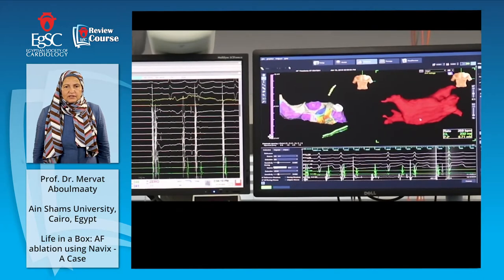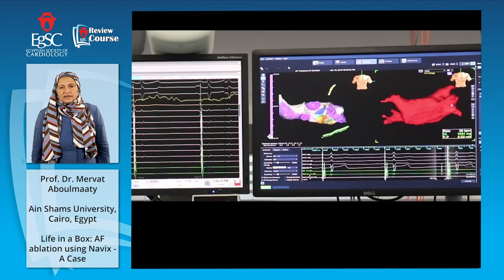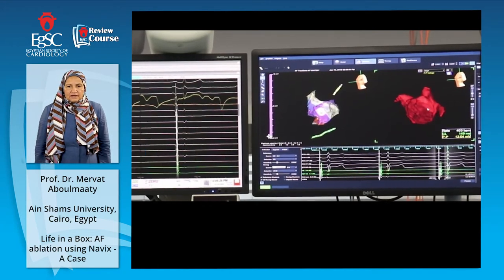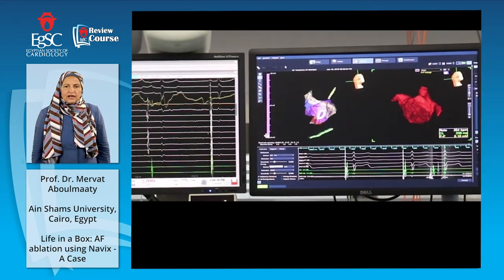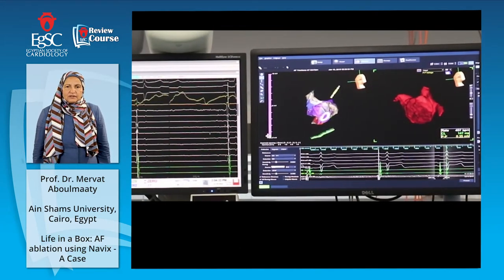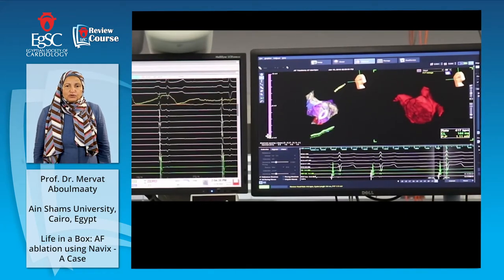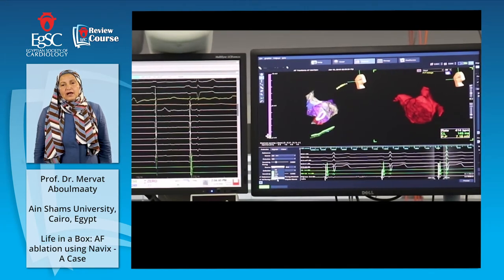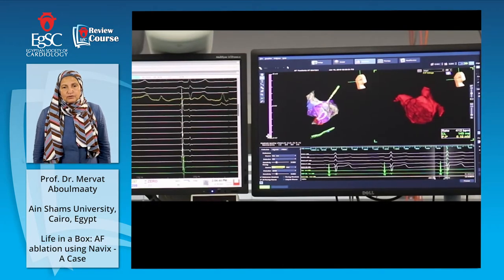The circular catheter is moving into the left side. The ablation catheter is in the left superior pulmonary vein. I'm now in the appendage. Yes, because I'm anterior. The roving catheter, the circular catheter, is mapping within the appendage. I have the CT image on my side and I want to imitate it. I want to get a good 3D, exactly like the CT image, and this is a very good help to me.